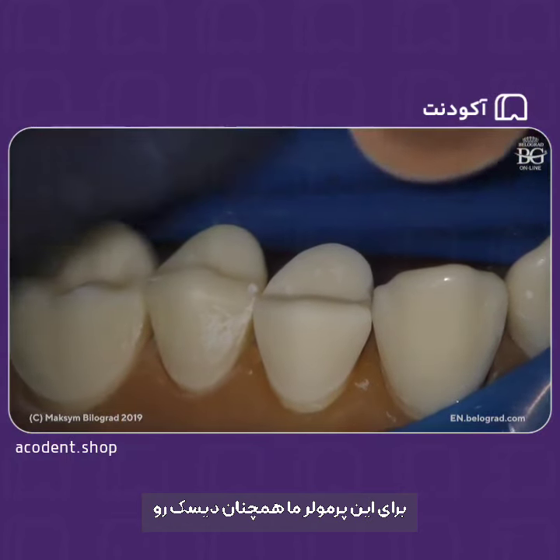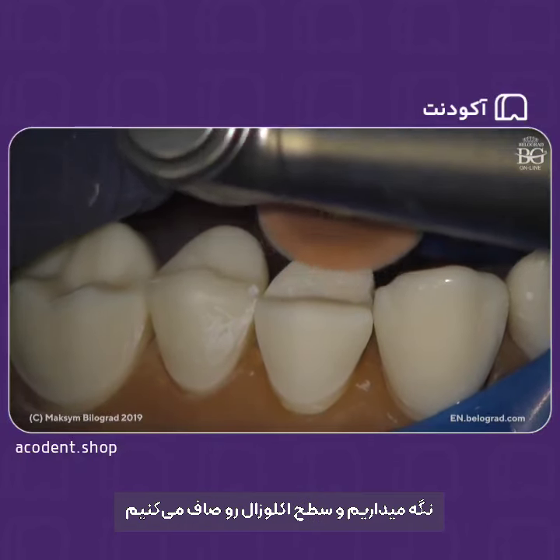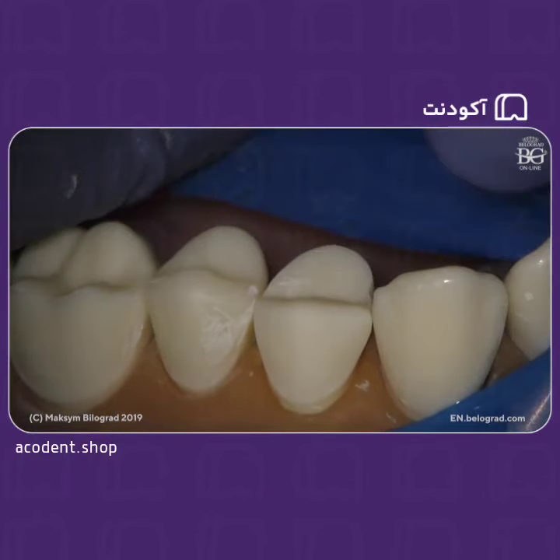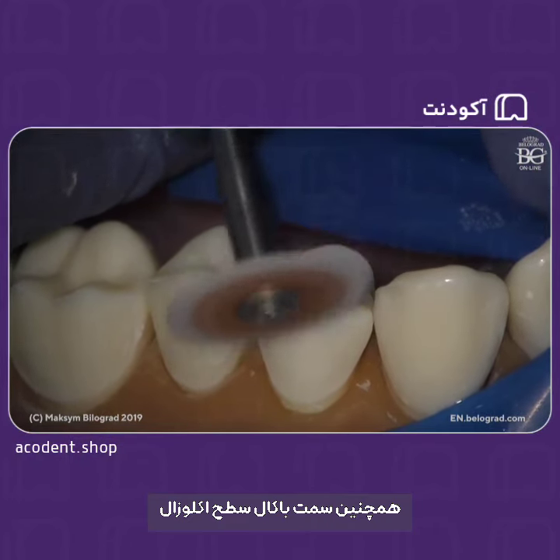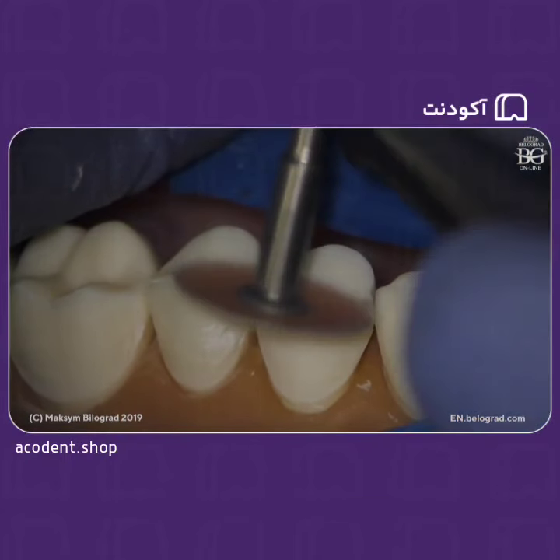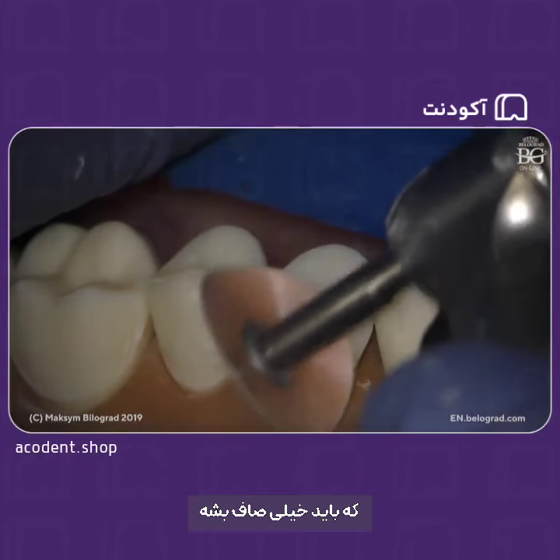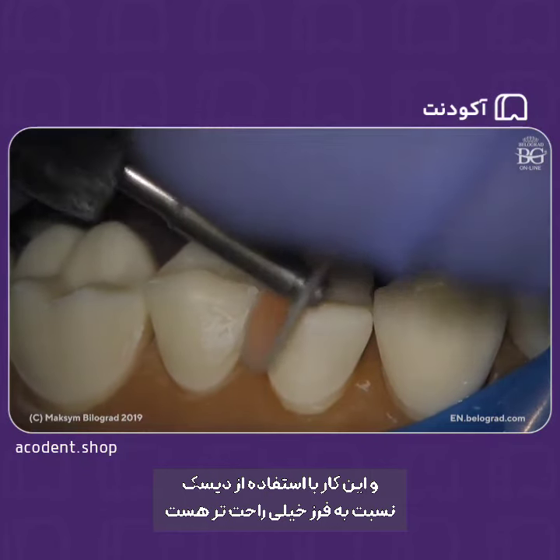For this premolar, we will continue having disc with abrasive in front. We will just make smoothening here on the occlusal surface, also on the buccal surface, occlusal surface, buccal side. And that transition, you remember, this transition, as we mentioned before, has to be super smooth, and with disc we can make it happen. It's easier than with burr.